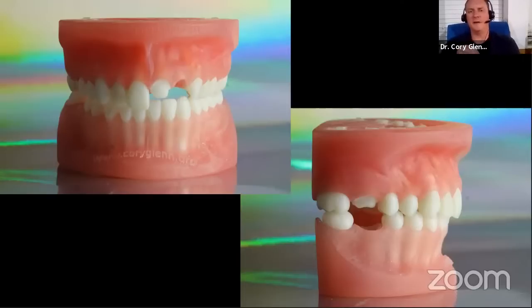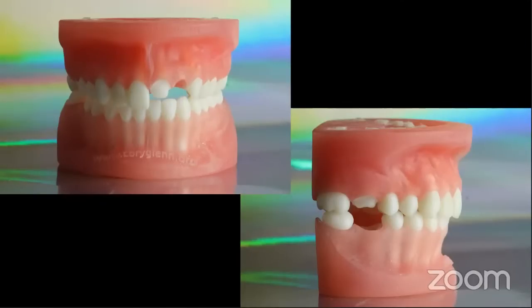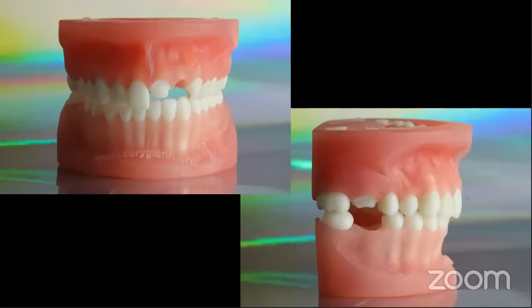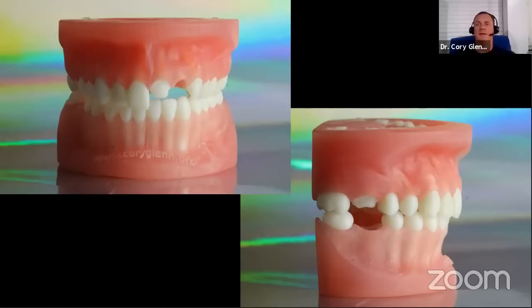Michael, are our articulator functions live yet in the software? Because I know we've got versions of that I've played with, but I lose track of what's live and what's public. Yeah, you could import the different bites. You could have the lower jaw open and close, move to different bite positions, view the contacts as it's moving from bite to bite. Yeah, that's live in the software. And that's in model editing, right? It also exists in ortho. There's actually a panel for buccal bites that focuses on the functionality. Okay. So yeah, that's the answer.